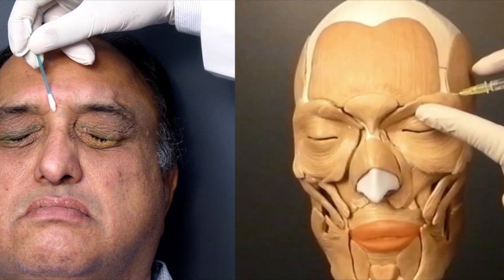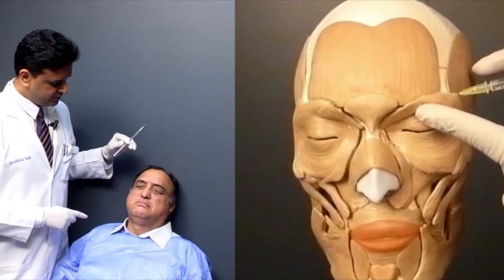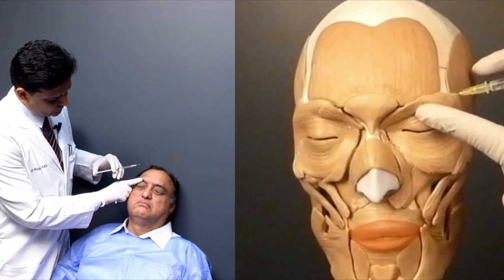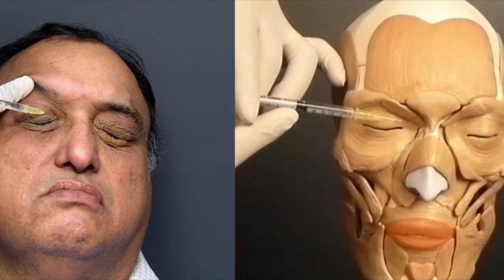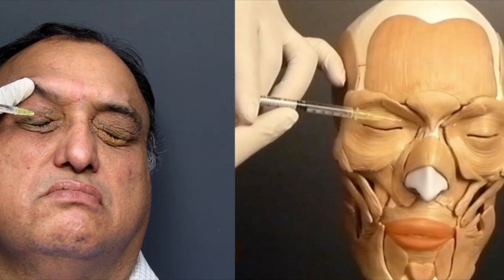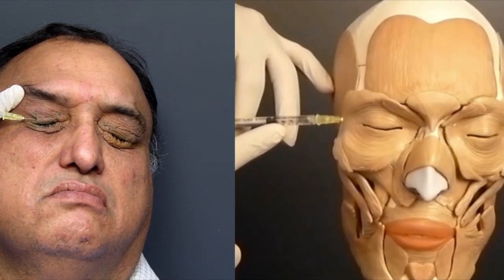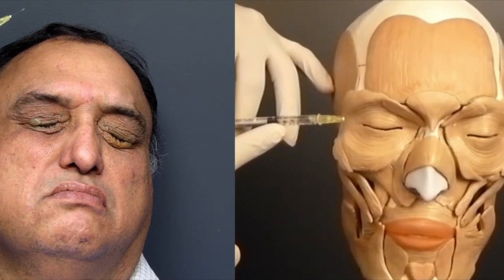Keep a cotton bud or tissue handy in case there is some ooze. I have now changed the syringe and we are going to inject the right side. Again, my non-dominant hand holds the eyelid pushed apart. We will start with the medial pretarsal injection, just going underneath the skin, lifting it up slightly, and raising a wheal very slowly — the slower you inject, the less pain the patient will have. We will also do the lateral pretarsal injection. The upper medial and upper lateral are now over.